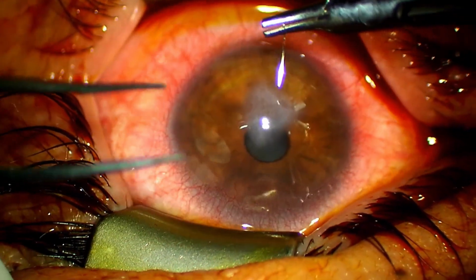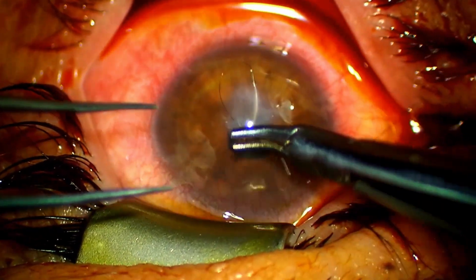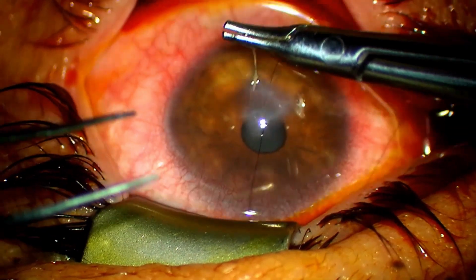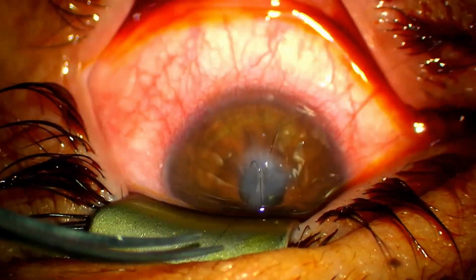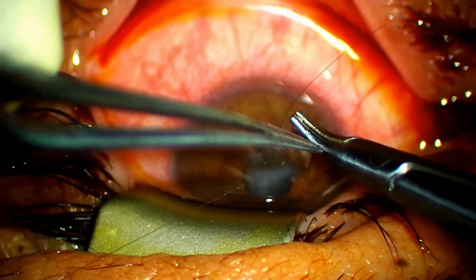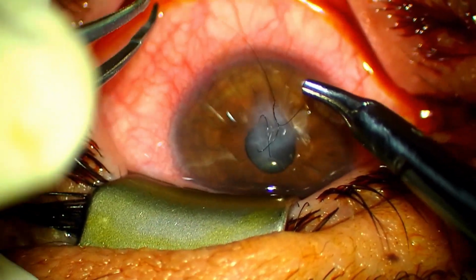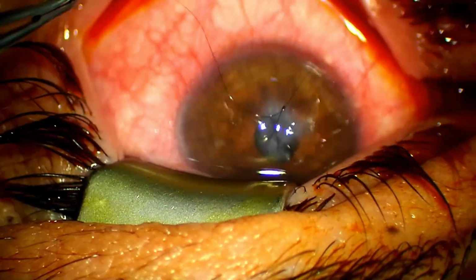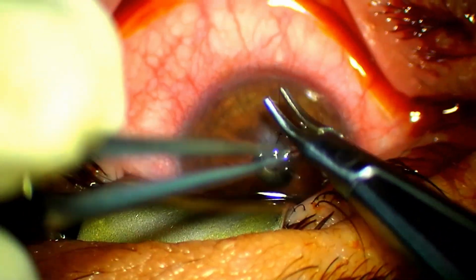The number of sutures depends on the size of the Dua-Descemet layer's break, assessed during corneal OCT, and not by the size of the edema, which is greater. Sutures are separated by 1 mm of distance. Leakage is expected since the suture often reaches the subepithelial space and shouldn't be frightening for the surgeon.